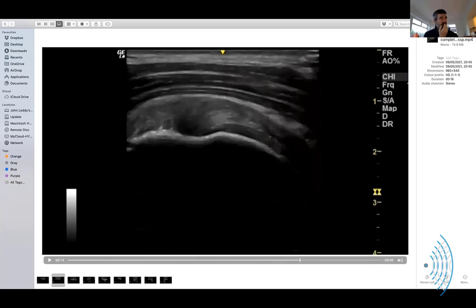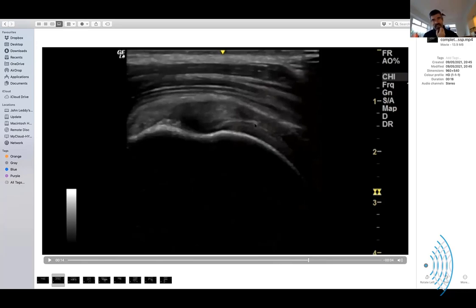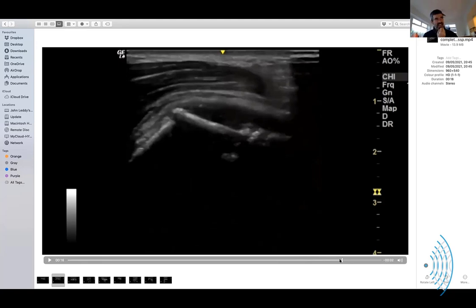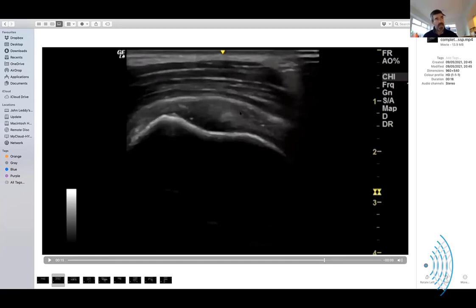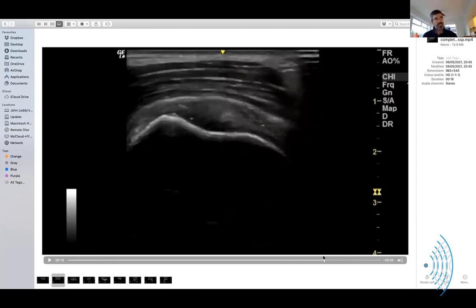Now, this is the supraspinatus here in long section. That's a bit weird, because there's a little bit of the remains of a stump there, but it's not actually going round. A bit of the leading edge is still stuck on that greater tuberosity, but not much. The supraspinatus is gone. Mostly they pull off the greater tuberosity, but this one's greater tuberosity has still got its shape. Massive tears don't normally keep their shape, but there's still some stump attached and it's torn just proximal. You're predominantly long axis on the supraspinatus tendon here, but a little bit oblique. I was trying to be long axis. This is probably long axis, but that's a stump and then it's gone.